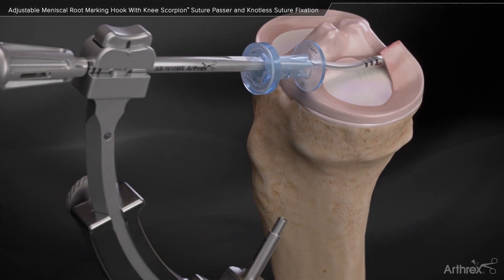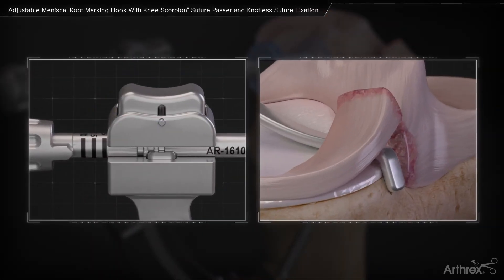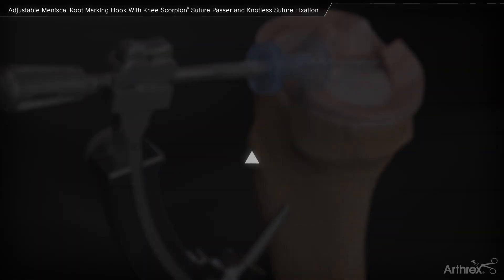Insert the adjustable root marking hook to an over the back position. Depress the locking button to adjust the offset of the drill. An offset of five, seven and a half, and ten millimeters can be selected. Adjust the drill sleeve to the appropriate angle.